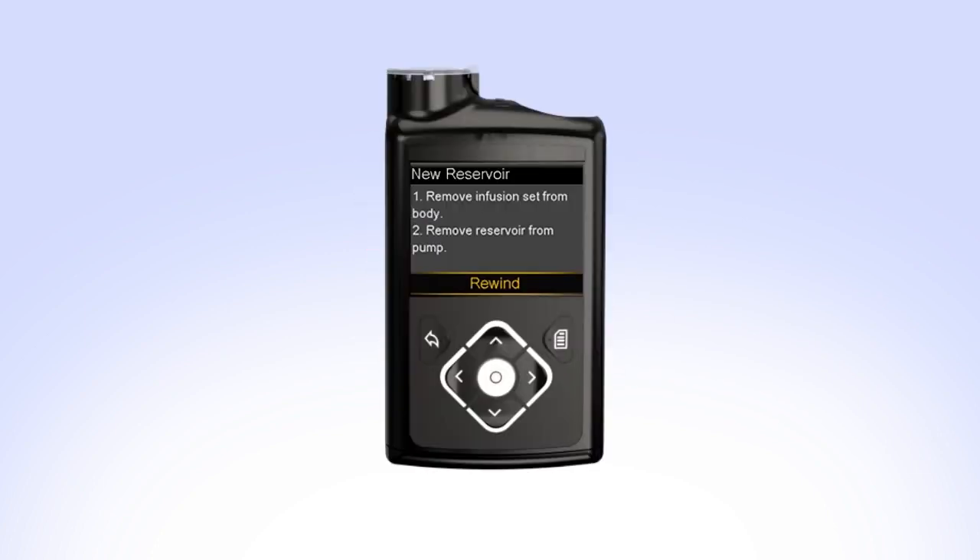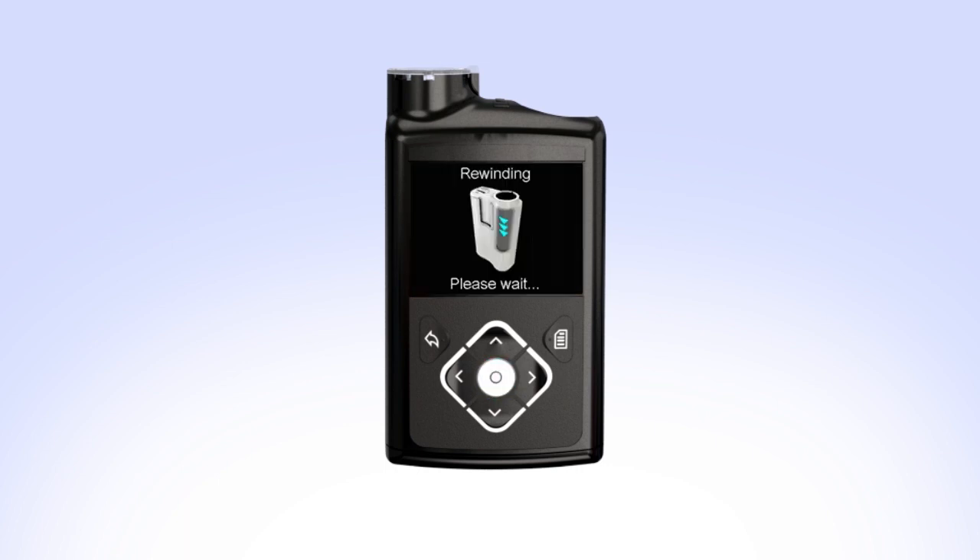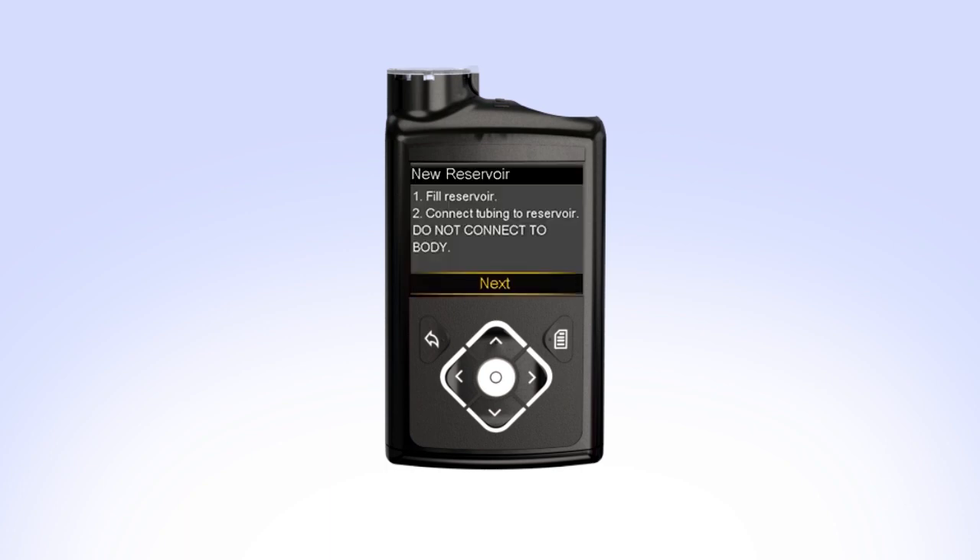In order to make room for a newly filled reservoir, the piston inside the pump will need to be moved back to its starting position. To rewind the piston, select Rewind. The rewinding screen will appear while the piston rewinds. Once the piston is rewound, Rewind Complete will appear on the screen. Your pump will then instruct you to fill the reservoir and connect the tubing to the reservoir.